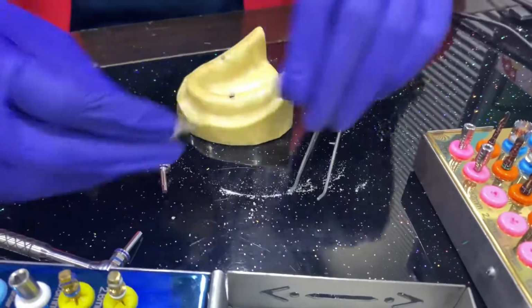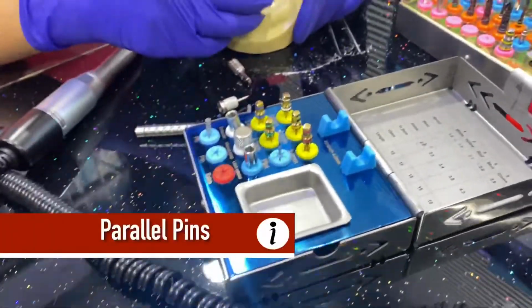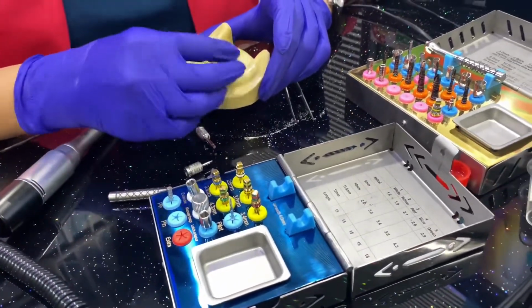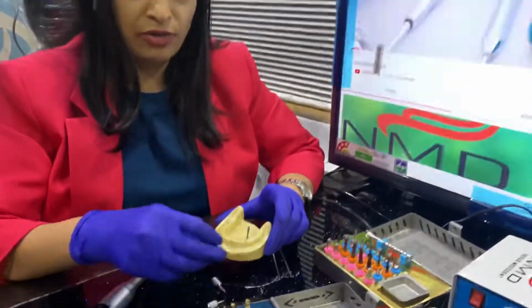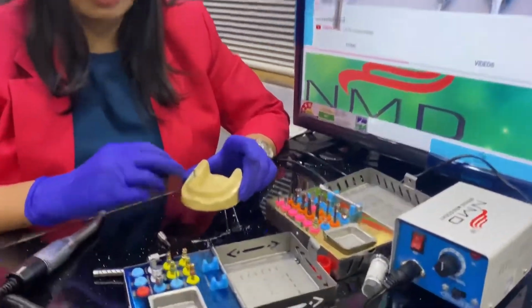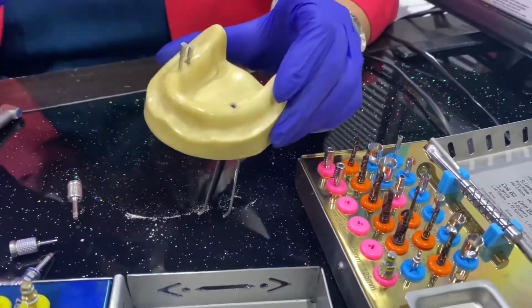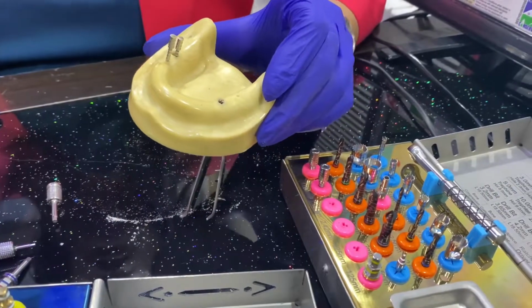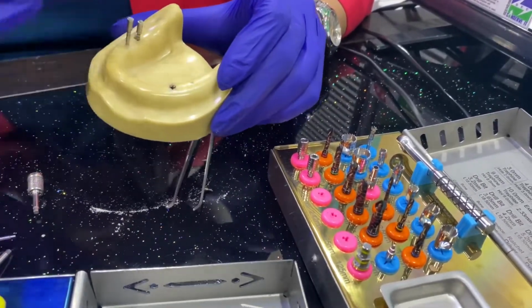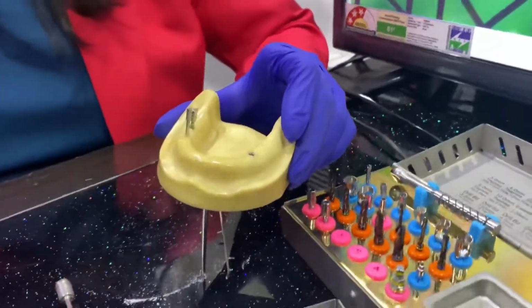The other things in the kit: if you're placing multiple implants, you can use the paralleling pins so that each of your implants is parallel to the other. Supposing I have placed one implant, one drilling here, and I want to place the other. So each implant has to be parallel to the other. So how do I define that? So I use these paralleling pins, which helps me to see that all the implants are parallel to each other.